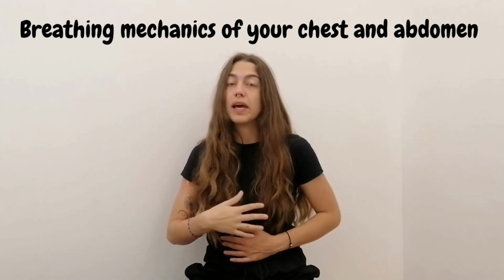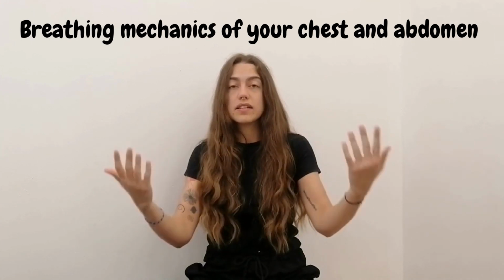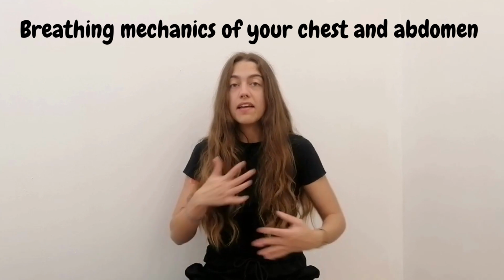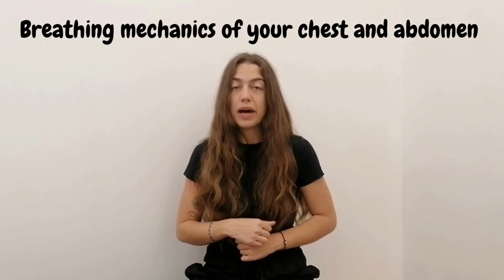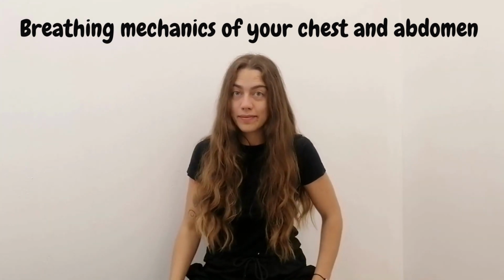What else do we measure then if we're measuring breathing? Well, when you breathe in and out, your rib cage expands and your diaphragm contracts to create the negative air pressure that sucks air in and the positive air pressure that lets air out. So for people with sleep apnea, this breathing mechanism becomes dysregulated, and we can measure it by strapping 2 straps across our chest. Let me show you what I mean.